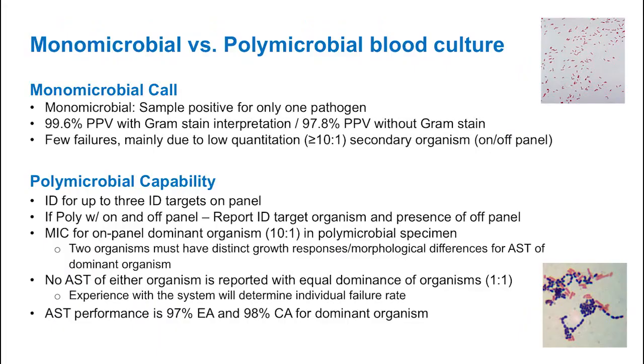Okay, how about monomicrobial versus polymicrobial calls? I was talking earlier that there was an issue sometimes with our molecular systems in not being able to tell us if there was a polymicrobial issue.